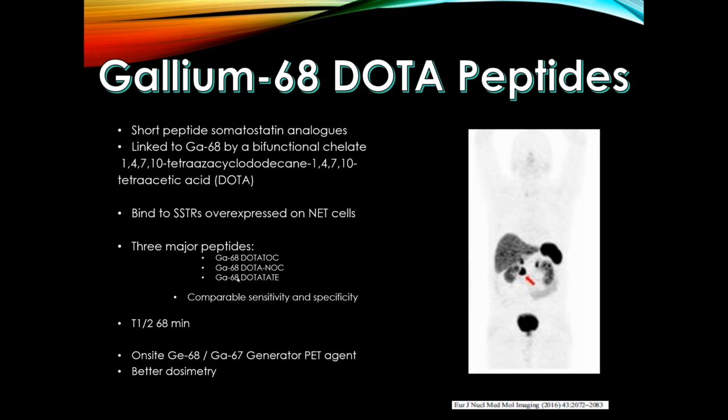For the most part, we only use DOTA-TATE, but you will see that they are comparable in terms of accuracy, sensitivity, and specificity. So very similar so far from the data, from the research. They have a half-life of 68 minutes, so very short compared to the 2.8 days that we saw with the indium. And we can use a generator that's on site in the hospital.